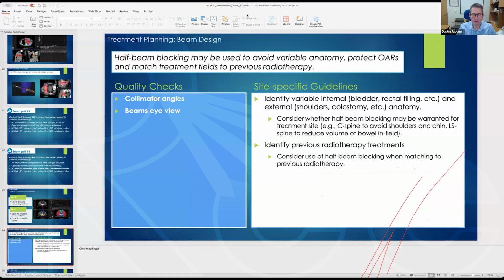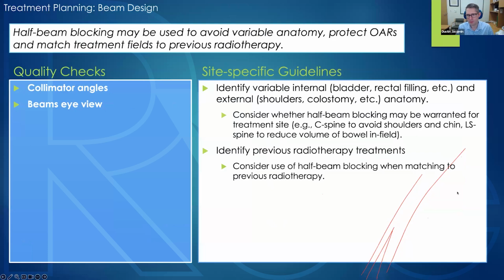So often you're looking at the V18 gray. It's very rare that you'll actually exceed the traditional tolerance dose in palliative radiotherapy. So very often the physicians in my clinic just want the kidney dose to be as low as possible. The kidney is a parallel organ, so any radiation exposure to it causes some loss of function. And so, when a patient is in a palliative care situation and their kidney function is already compromised, very often the physician just wants it to be as low as possible.